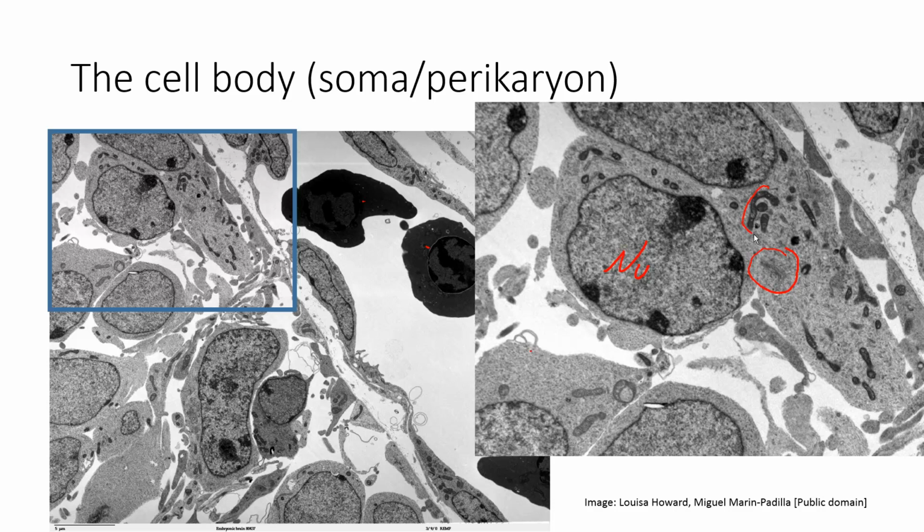Neurons are very, very energy-hungry cells. When you sleep at night, you're still burning tons of calories because your brain is still firing. So these cells are very energy hungry, and so you're going to have lots of mitochondria down in there. And then finally, and it's probably a little bit difficult to see on the video screen, but over in here we have some developing neurofibrils.